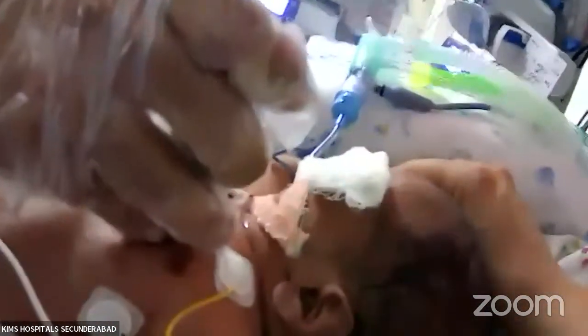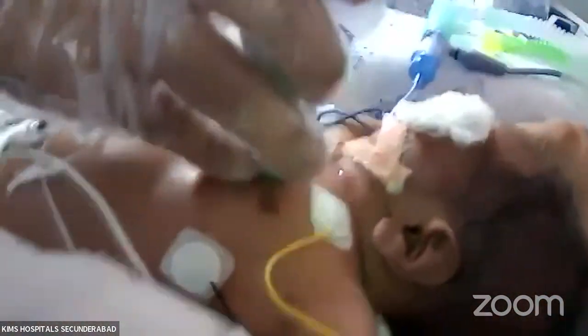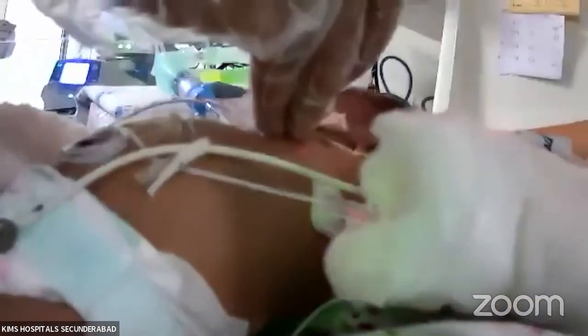Go a little anterior, you will be able to see the aorta. More anterior, you are able to see the pulmonary artery, but not in the same plane. In the same way, go up at the second and third space with the marker on the right shoulder. With the probe a little horizontal, you will see the parasternal long axis. If you go more anterior, you will see the pulmonary artery. Posterior tilt, you will see the tricuspid.